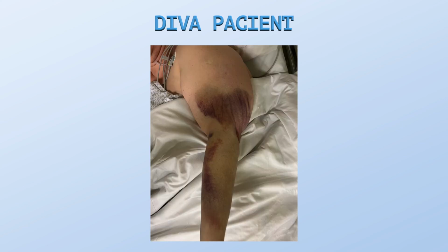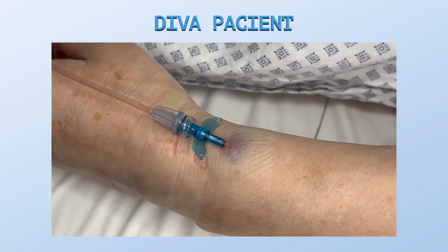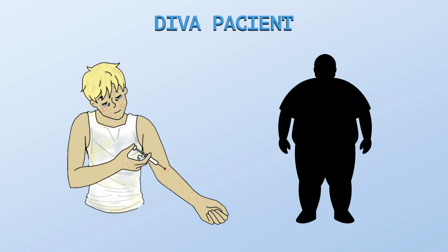So the patients are individuals from all age groups who are expected to have difficult venous access. To assess the risk, we can use a risk scale and its modifications. This group includes, for example, individuals with a depleted venous system, drug users, obese patients, seniors, cancer patients, people with tattoos, and others.